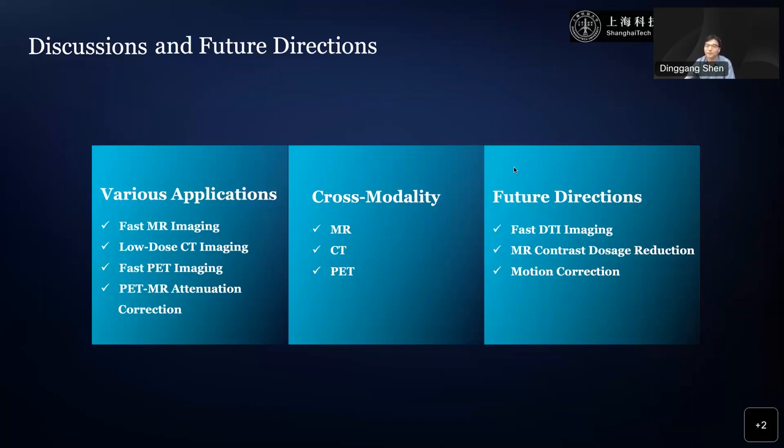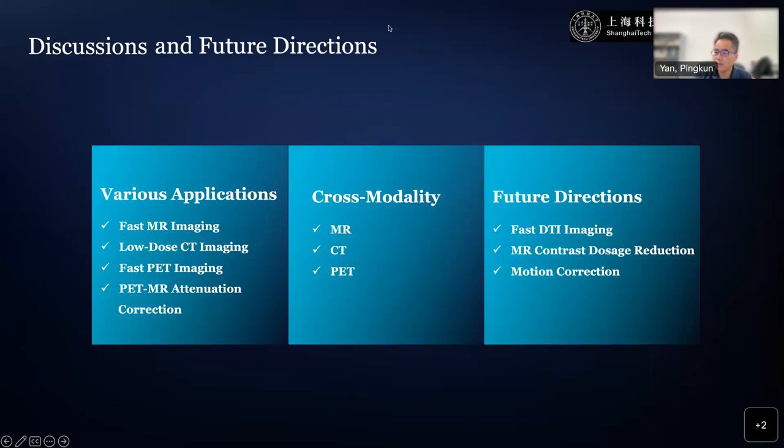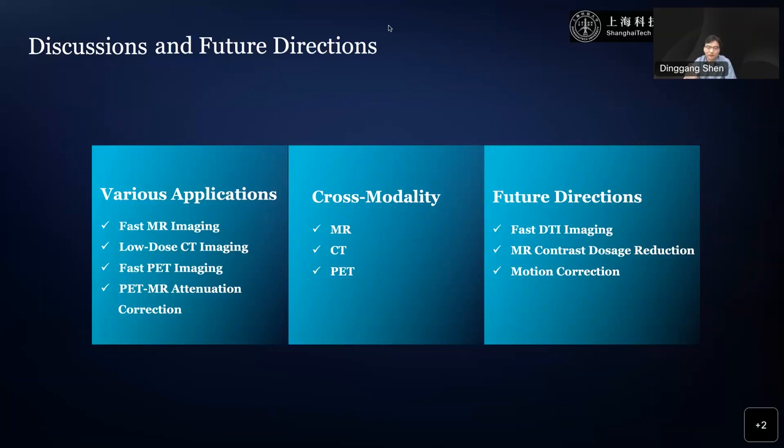Okay, all right. The next question: for the quantitative results, do we have the paired data after registration for a reader study? I think it refers to one of the reader studies for the reader scoring. Yes, like I mentioned, you always have the standard dose image, or the original image, what we call the gold standard. For the CT image you have the standard dose CT, and for the PET image, for example, the original scanning time. So you have the comparison.